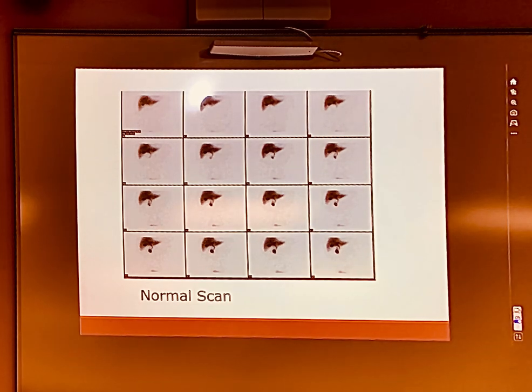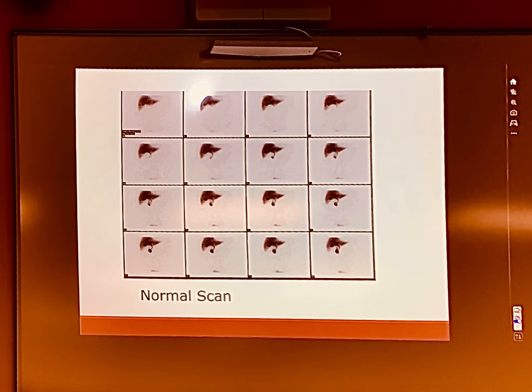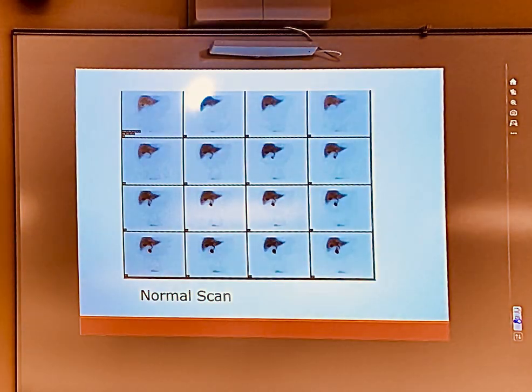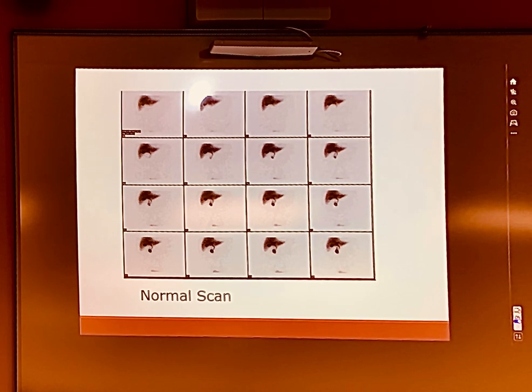So here's your intrahepatic ducts, gallbladder. If you have a patient that you think might be gallbladder and you're not sure if it is gallbladder or not, you're not going to send the patient to CT. You are going to do a lateral or an oblique, okay? Because you want to see if you can make that gallbladder move. If the gallbladder stays in the same position when you turn the camera, it's probably a dilated duct and not the gallbladder, because the gallbladder is another organ and it will move when you take angled pictures. If it stays in the same spot, it's probably a dilated duct.